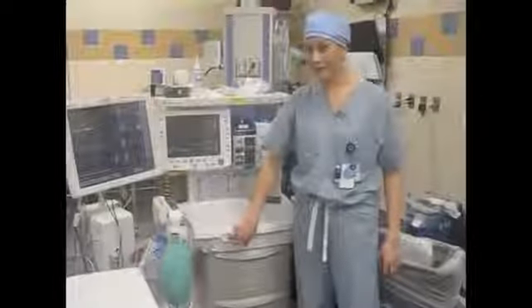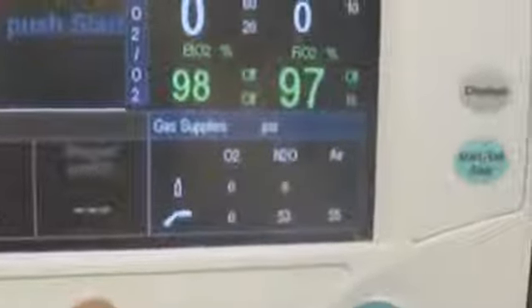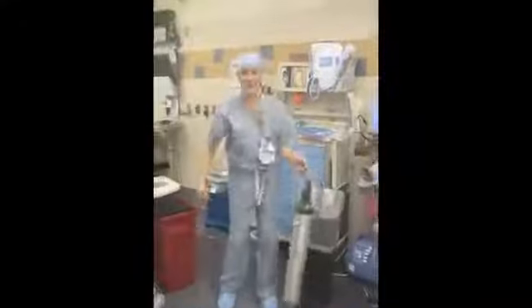Leave the system, get it all back down to zero. Don't forget you've got to close that O2 tank. Keep an ambu bag nearby and make sure your O2 tank is full. Just in case, don't freak out.